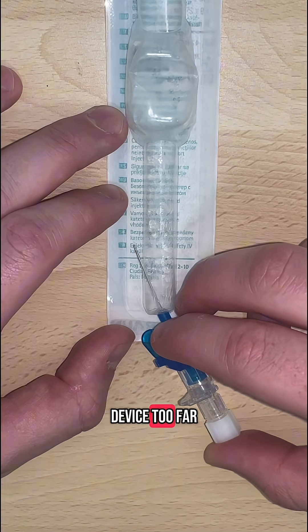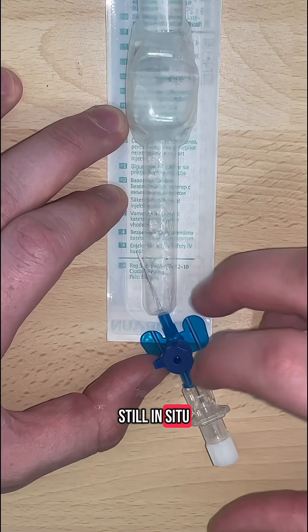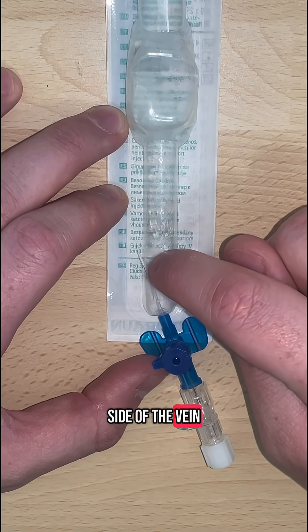Be sure not to push the device too far whilst the needle is still in situ. Otherwise, you risk perforating the other side of the vein.